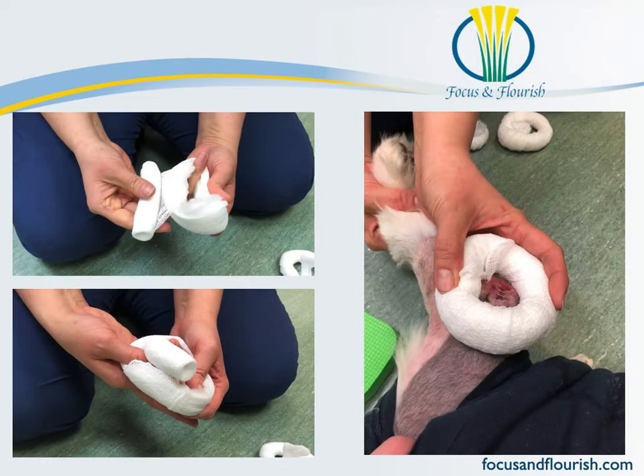She continues with the cling around the original cast padding until she has a doughnut about the size and thickness that she wants it to be, and applies it over the bony protuberance that she is looking to protect.